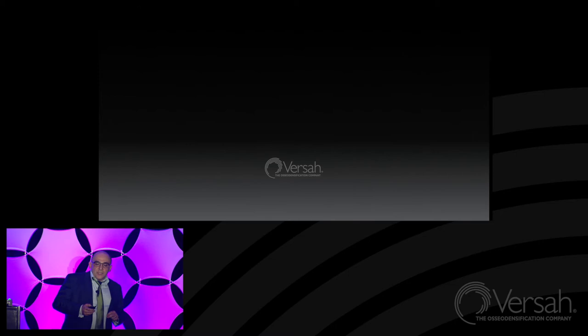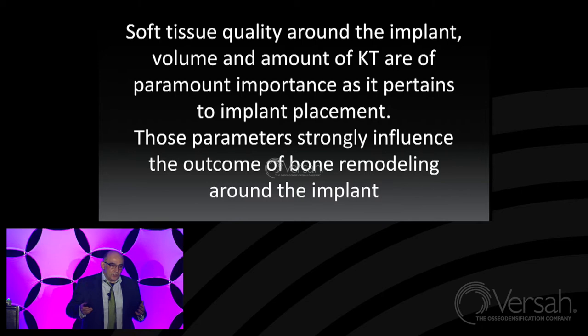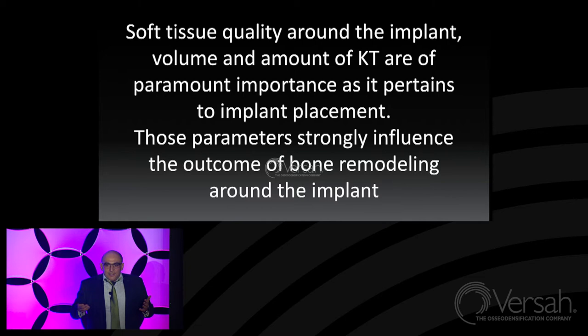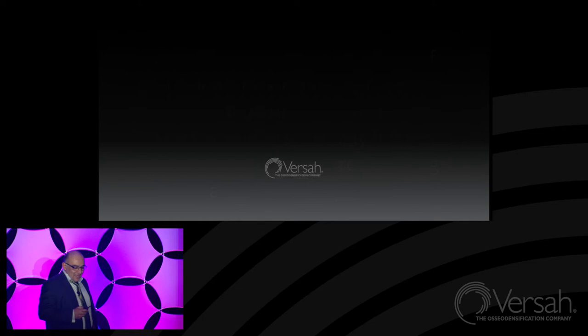Along with this amazing invention of Salah, along with osseodensification, because as we heard today, those dentists who began to use these drills throw away their regular kits, using only implant drivers, and that's it. At least I do it in this way.